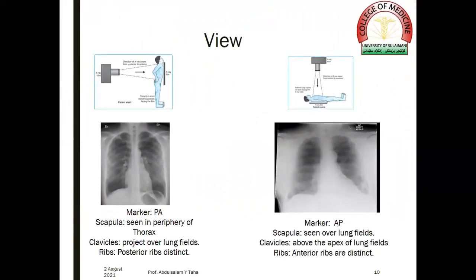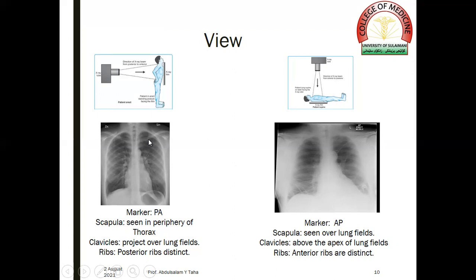Comparing the PA view with the AP view: the marker reads PA in the PA view and AP in the AP view. The scapulae in the PA view are seen in the periphery of the thorax, while in the AP view they are seen overlying the lung fields. The clavicles project over the lung fields in the PA view, while they are seen above the apex of the lung fields in the AP view. The posterior ribs are distinct in the PA view, while the anterior ribs are distinct in the AP view.